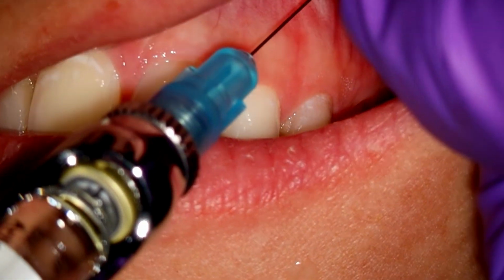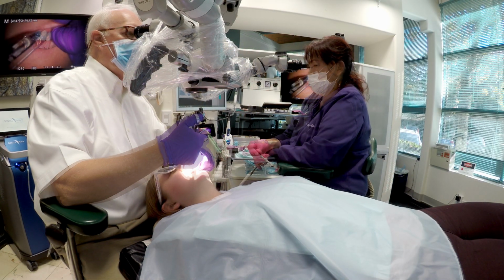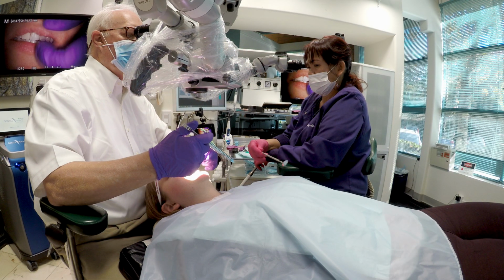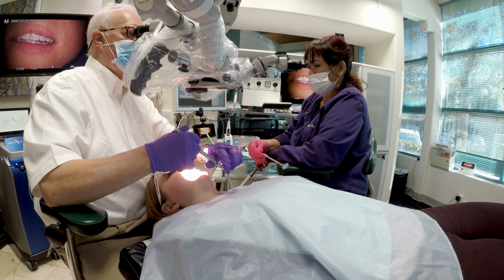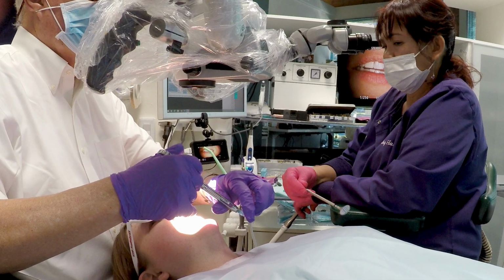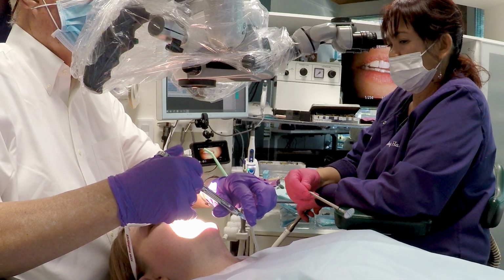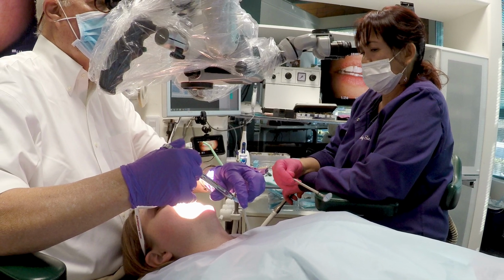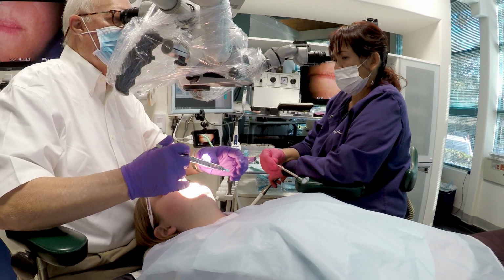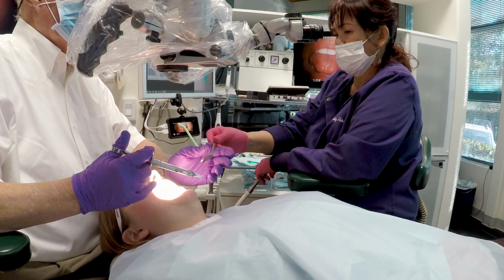So you'll notice there she's handed me the needle with the bevel pointed down. So little tiny things like that are shown up very well with these various angles. And as you can see, Joy has seen that I'm getting ready to give the lingual anesthesia. She has the mirror ready for me because she knows to do this precisely and painlessly, it has to be very exact. So my mirror has to be defogged immediately.